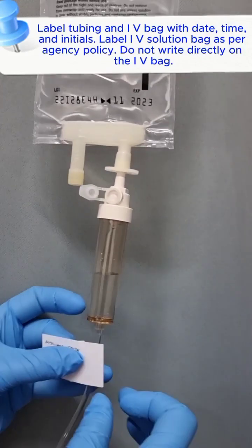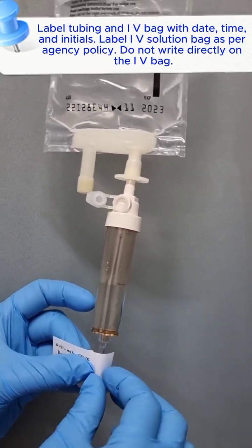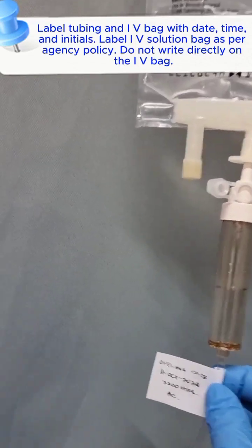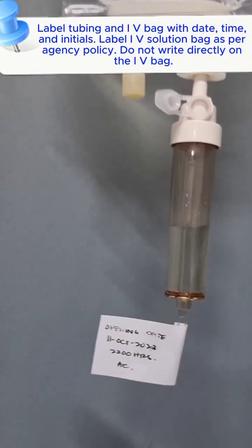Label the tubing and IV bag with date, time, and initials. Label the IV solution bag as per agency policy. Do not write directly on the IV bag.